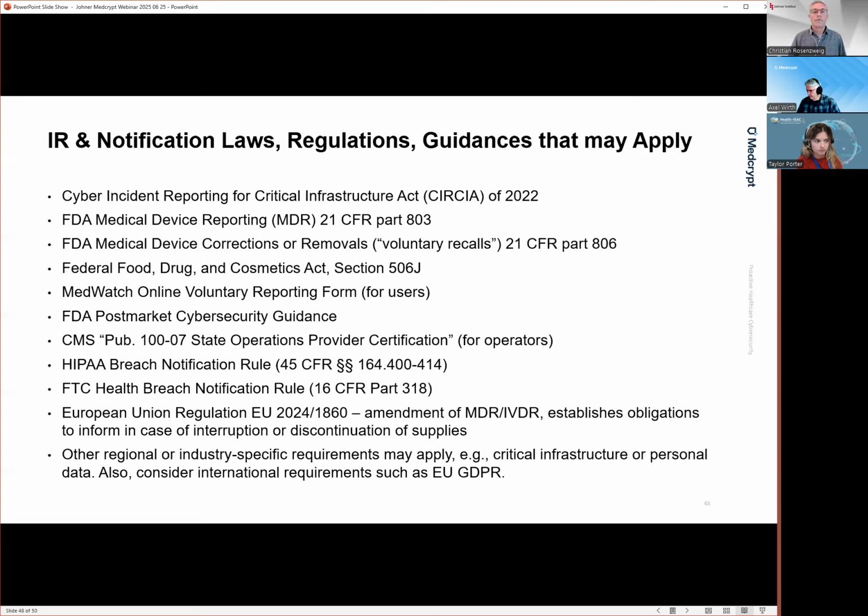That would be another difference. And by that, the timing is also different. You have more pressure because your devices are already in the market compared to the pre-market phase. Right. And you may have obligations for notification if there's a risk of patient harm. There may be specific timelines you need to comply with in the post-market. So yes, a good point, Christian. There are those kinds of differences.